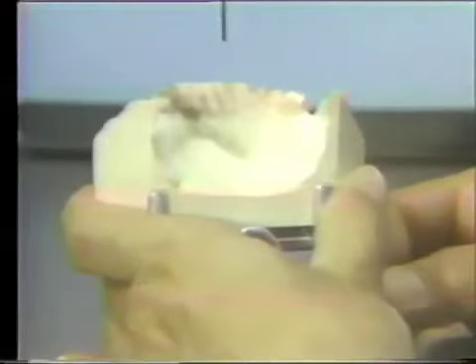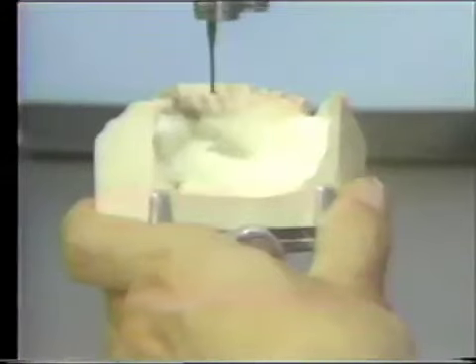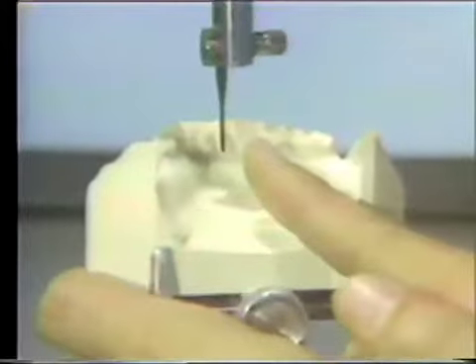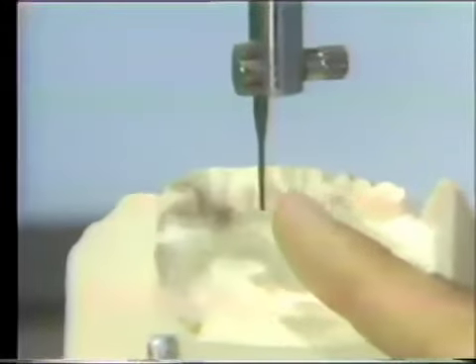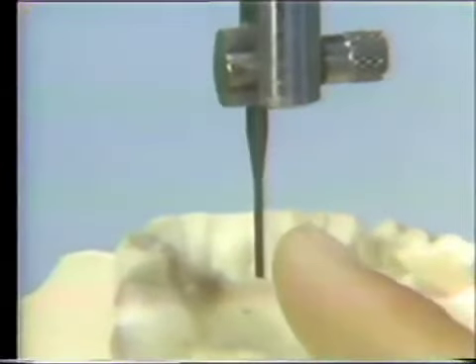Now, the first step in the survey procedure would be to mount the cast on the base mount or the cast mount of the surveyor. The first instrument in the surveyor that we'll use is the analyzing rod. The analyzing rod in the kit is sometimes bent when it comes from the manufacturer, so that should be checked.